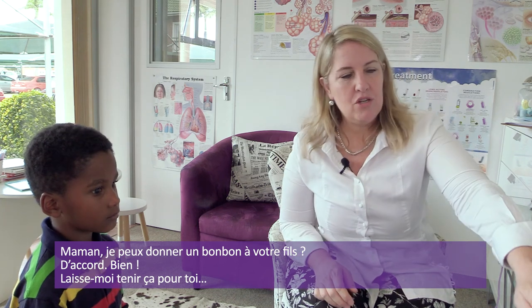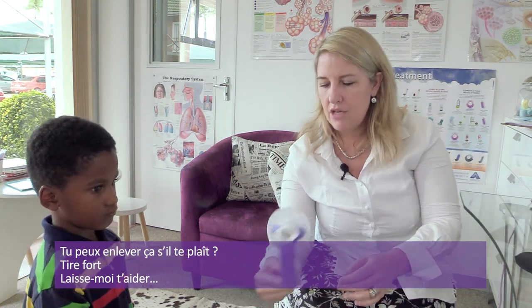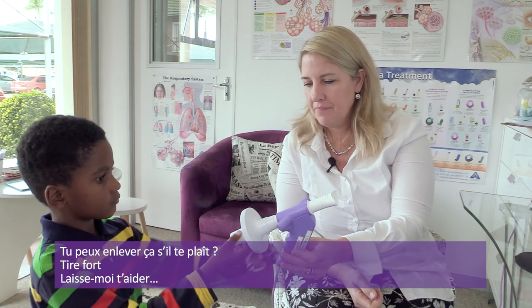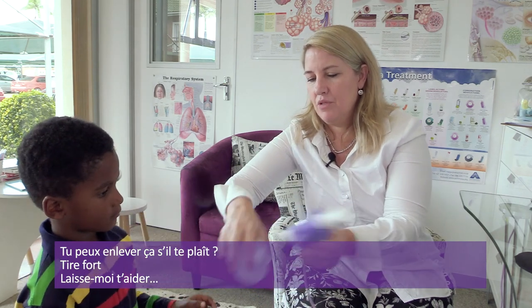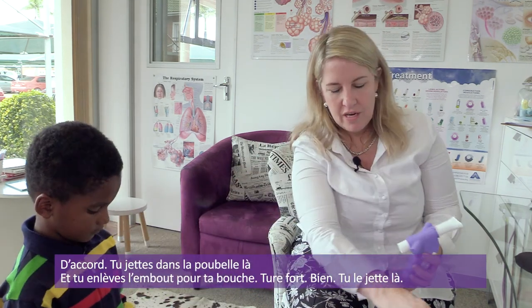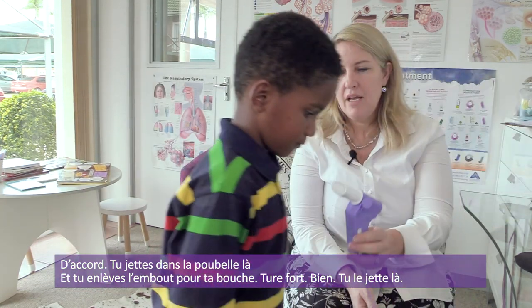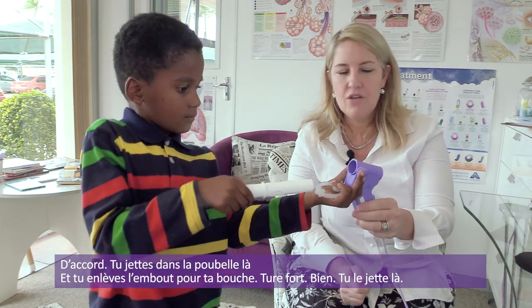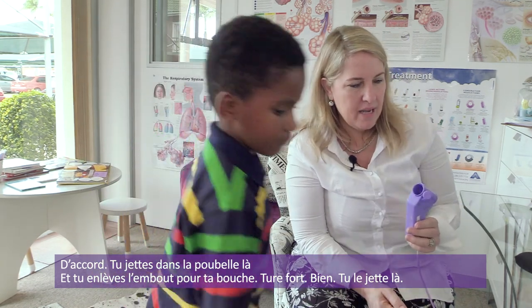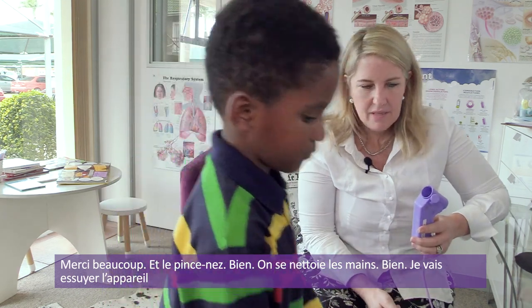Okay, good. All right, you can put your... Can you please just stop... Okay, let me hold this for you. Can you just take this off, please? Just pull hard. Pull hard. Let me help you. There. Whoops. Okay. You can throw that into the dustbin there. Good. And then you can take your mouthpiece out. Just pull it out. Good. And you can throw it into the dustbin there. Thank you very much. And your nose clips, you can throw into the dustbin.